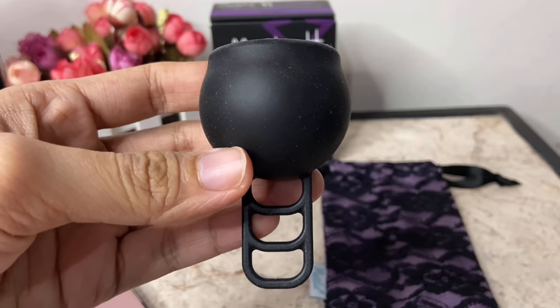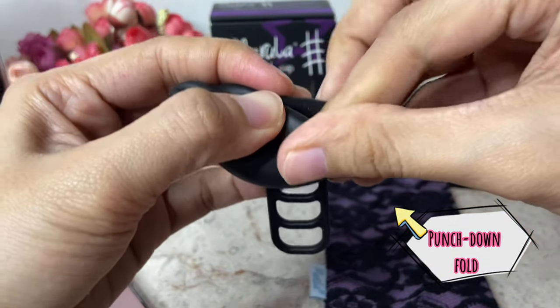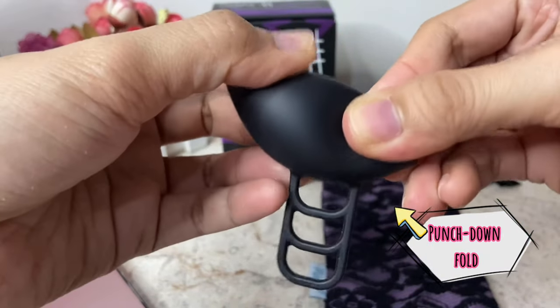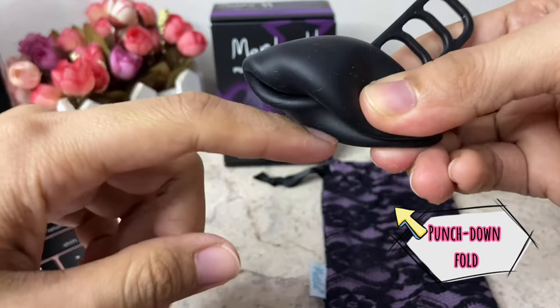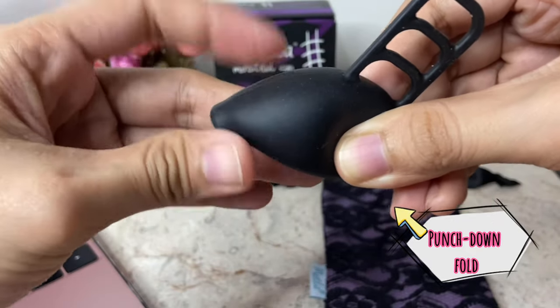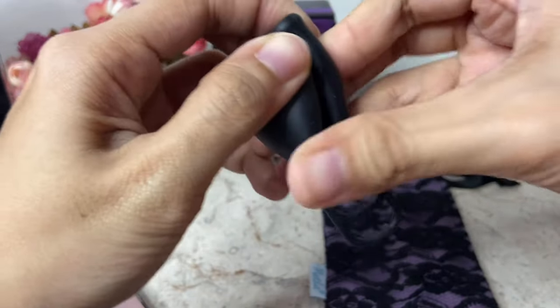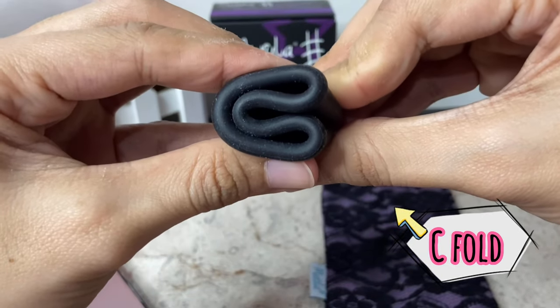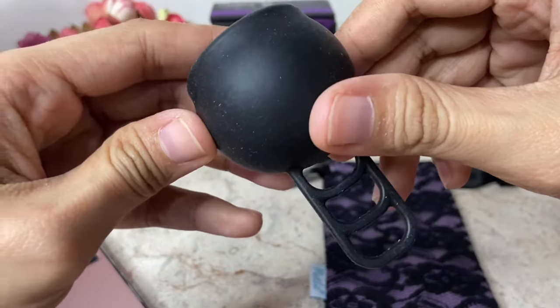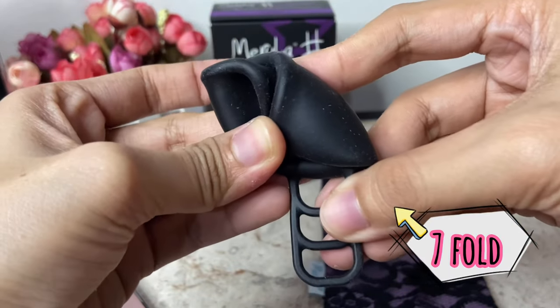You can use the basic cup folds for the Marula OS, like the punch down fold, which gives you a smaller insertion point. I suggest to do it with the fold facing downwards, so that part can glide easily inside. Another fold you can do is the C-fold, which pops open easily once inserted. You may also consider the 7-fold if it works for you.